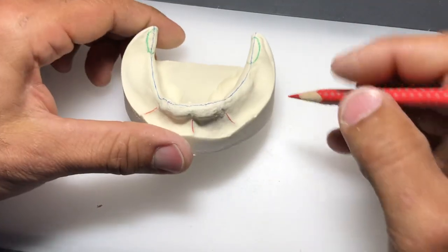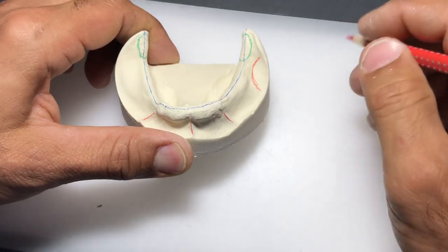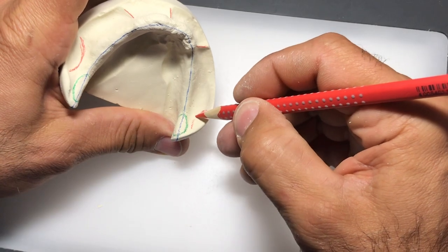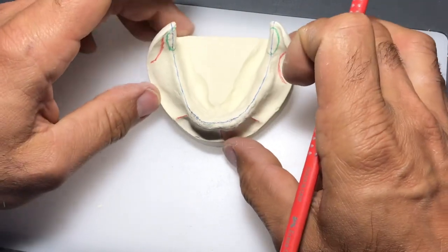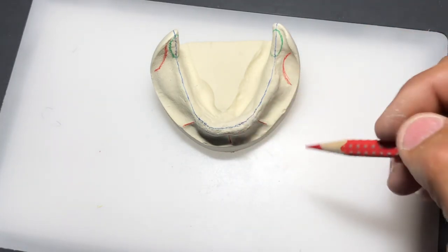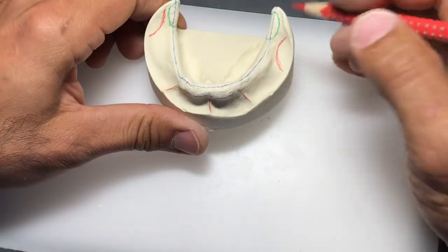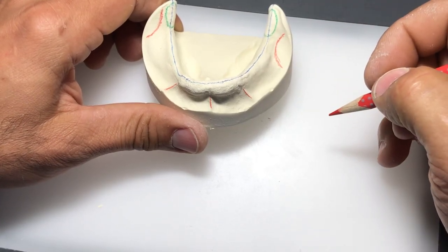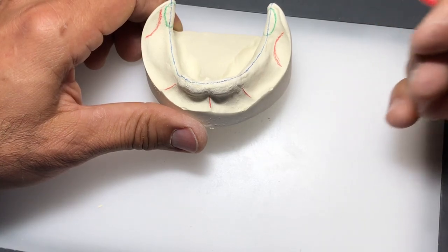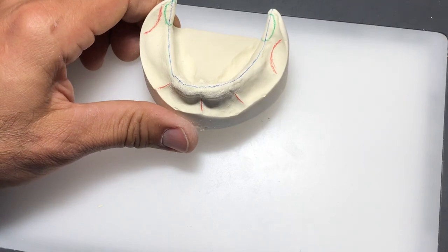Another area to identify is the masseter groove - this area right here - where the masseter muscle on the side of your face attaches to the lower arch. If you put your finger on the side of your face and clench your teeth, you'll feel it flex - that's where that muscle attaches on the lower jaw. We want to make sure our lower custom tray goes around that attachment, because if we cover it, every time the patient chews they'll flex the denture out of position. Any movement with the prosthesis in the oral cavity is not good.